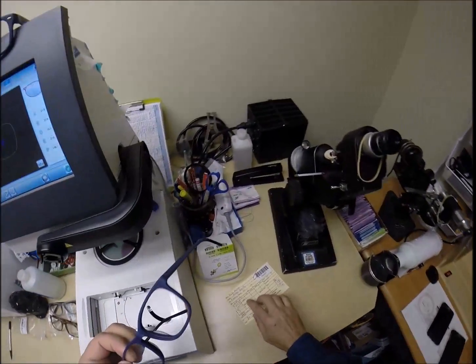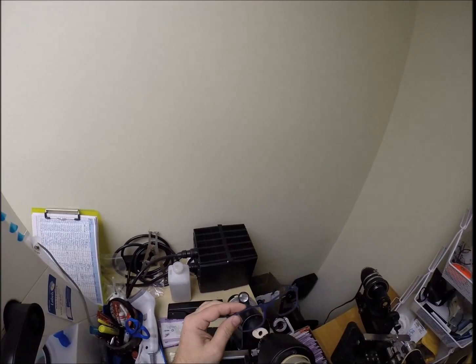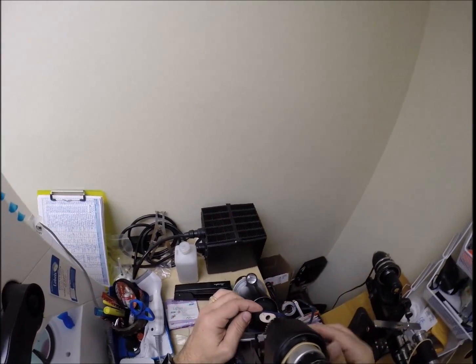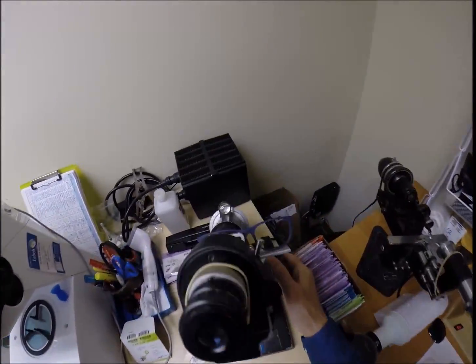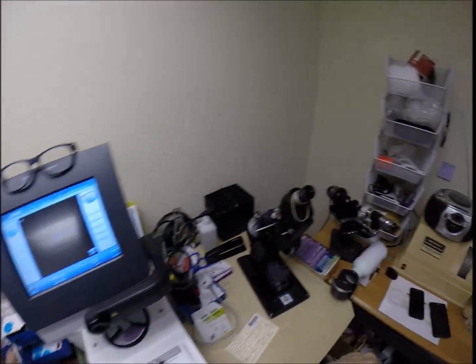So I'm going to come down here, back to my lensometer. Normally I would have to adjust the axis wheel. I don't have to do that on your prescription because your lens is completely spherical. I'm going to read the power of your lens.